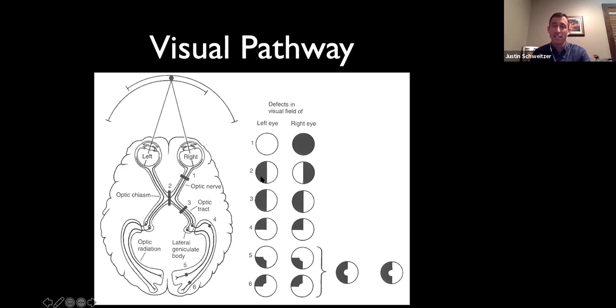If you see anything like 2, 3, 4, 5, or 6, okay, you can see it's in both eyes and symmetric, all right? This is much more likely and very likely neurological in nature. Okay, this is a red flag that there's something going on in the brain. Could be stroke, could be a lesion, a variety of different things. You don't have to know where it's affecting it in the brain. I don't care about that. This should just be a trigger that, hey, something's going on in the brain. It's probably not glaucoma. This patient needs something more from a workup standpoint. Okay.